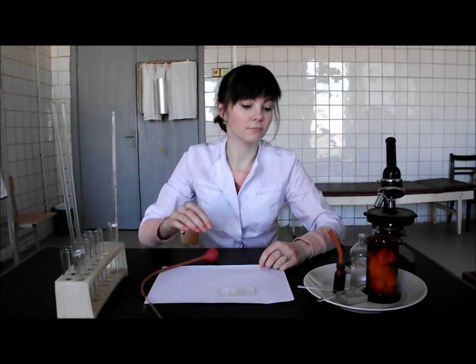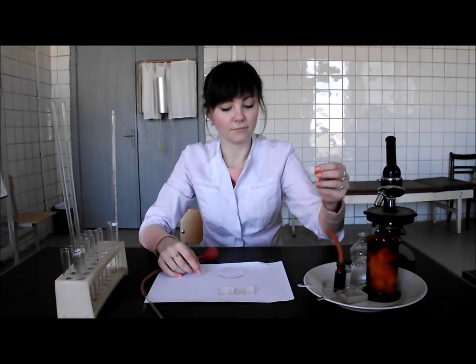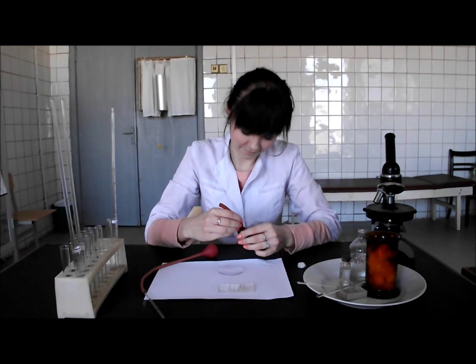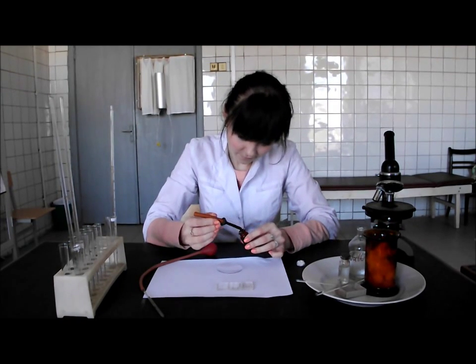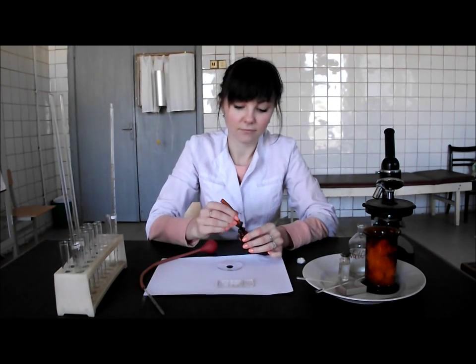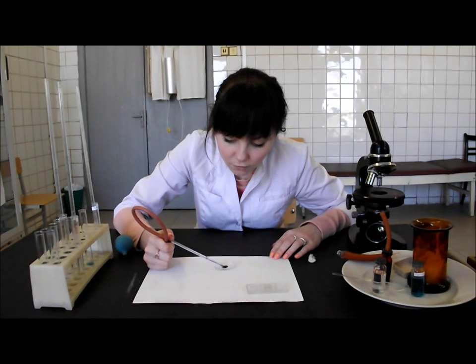Then take the watch glass and prepare a piece of cotton wool. Put a drop of blood on the glass. Clean the tip of the capillary with the help of cotton wool. Put the used cotton wool on the plate.